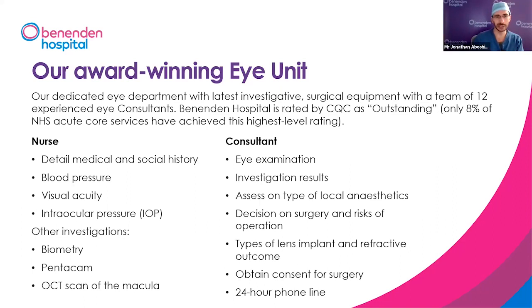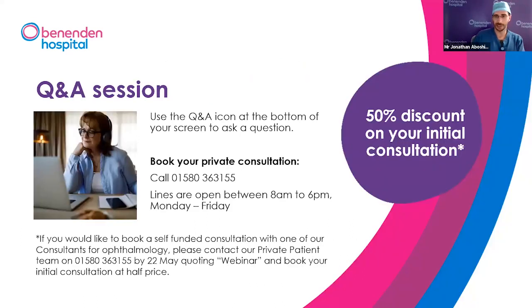It's a little bit quicker, just the way of things, if you are going down what we call the special lens route, and that would include anything from a toric monofocal, which is just correcting astigmatism, all the way through the EDOFs and the multifocals, which may or may not have the toric correction in them as well. And of course, we've got a really good support team and a 24-hour phone line afterwards if you have any questions or concerns. So I think that's me done. Sorry if I rabbited too quickly. I will hand over to Louise for the Q&A.